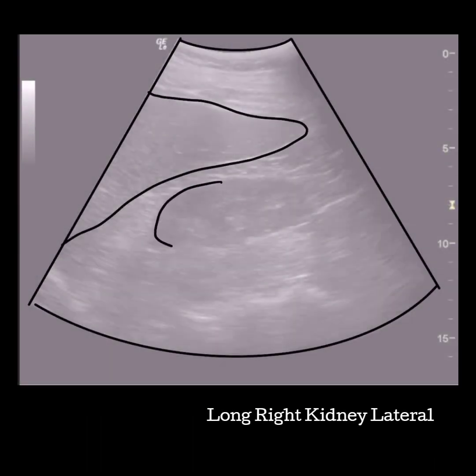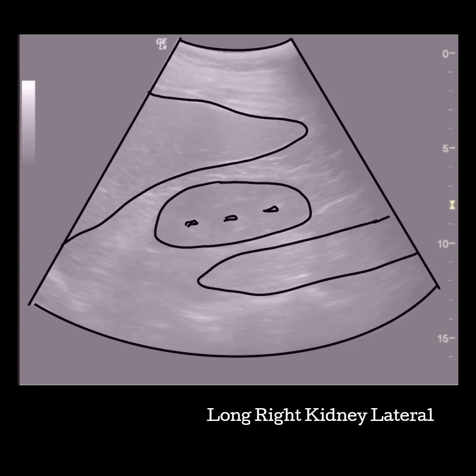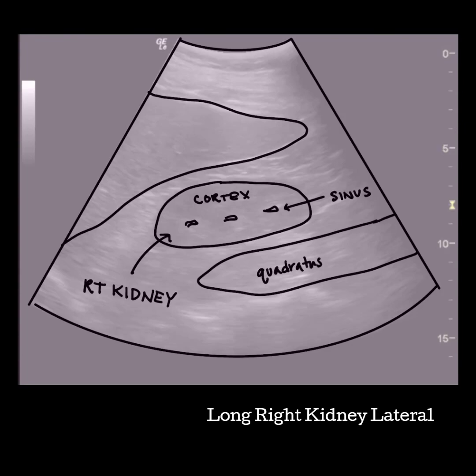The kidney appears hypoechoic compared to a normal liver, which sits superior to the kidney. Very little sinus should be seen, if any. Make sure that you can see all the borders of the kidney. The quadratus muscle is in the lateral plane inferior to the kidney.